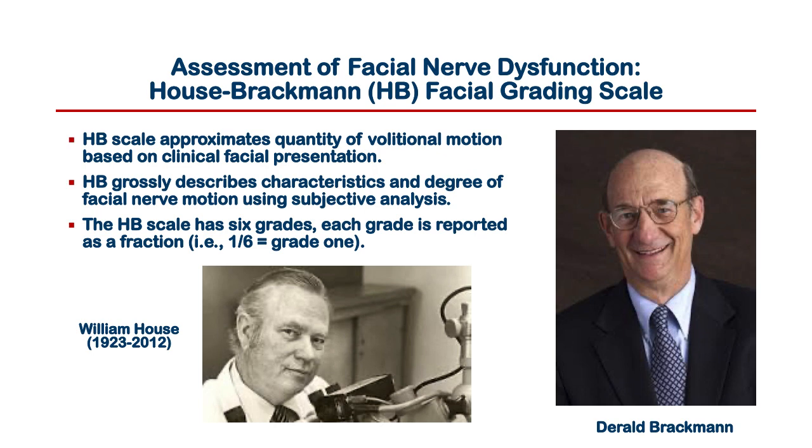But most people don't have the equipment. Most people can't perform ENoG. Certainly, physicians in a typical office, or an otolaryngologist in a hospital who is called to consult on a patient with facial paralysis, don't have ENoG, so they have to have some way of measuring the extent of the problem, of documenting or grading its severity.